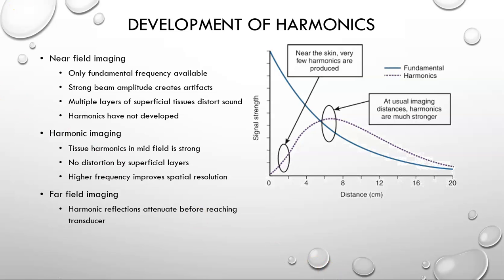So as a general rule of thumb, we can say, where are harmonics useful? In the midfield. Why? Because they haven't developed in the near field and they're absorbed in the far field.